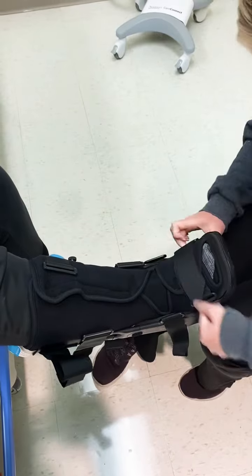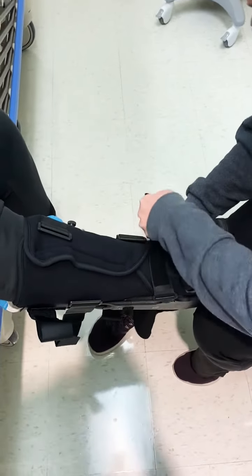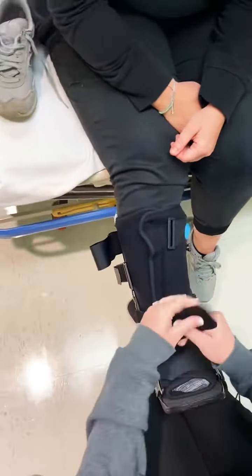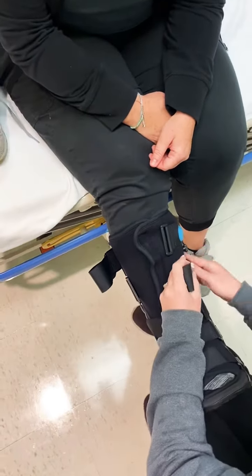Leave the Velcro shut and the rest is also just Velcro straps. You want to pull these nice and snug so it's secure around the foot and ankle, but you don't want the patient pulling it so tight that their toes go numb and tingly. Tell them to pull it so it's secure and comfortable but not causing discomfort.